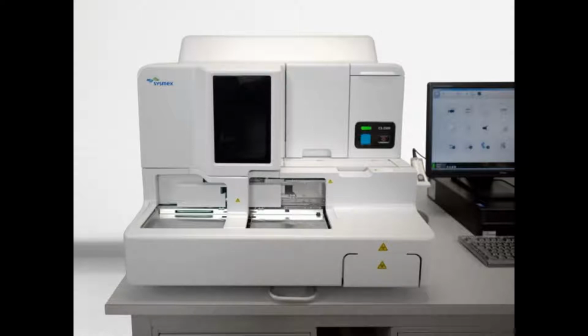Now that the QC is ordered, loaded, and ready to go, press the blue button on the right-hand side of the machine to start the process. After you're satisfied that the QC is complete and passed, you can now begin running patient specimens. Congratulations!